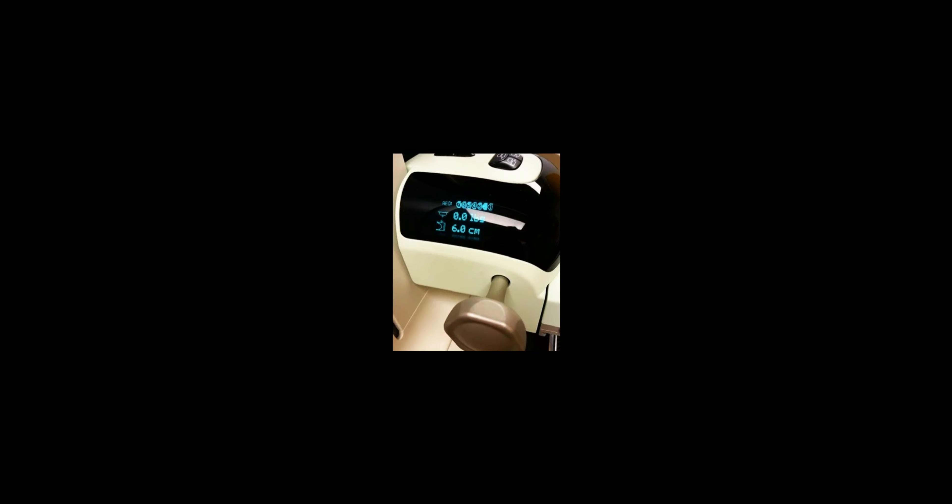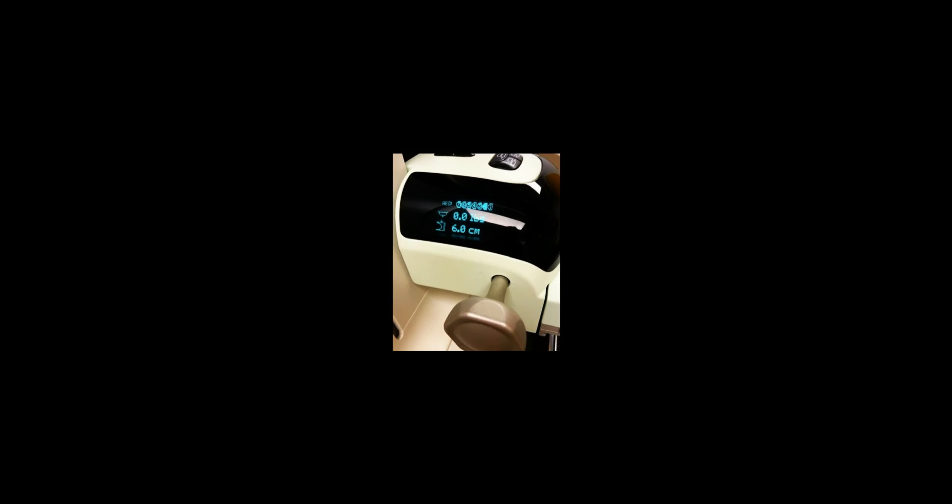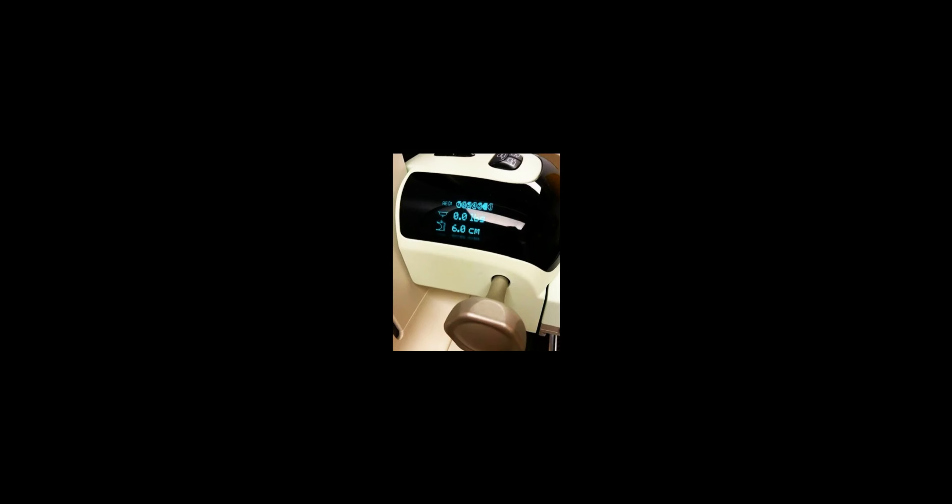The artifact evaluation is done to ensure that any undesirable artifacts are free from our image so that we can visualize suspicious anatomy in the mammogram. In order to perform the quality control task of artifact evaluation, we want to first ideally perform this after our detector flat field calibration or gain calibration.